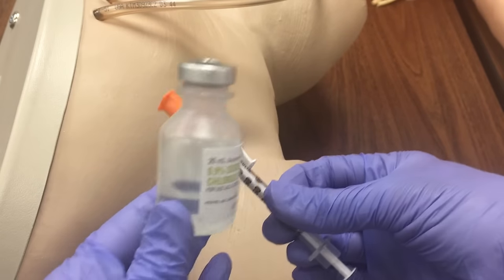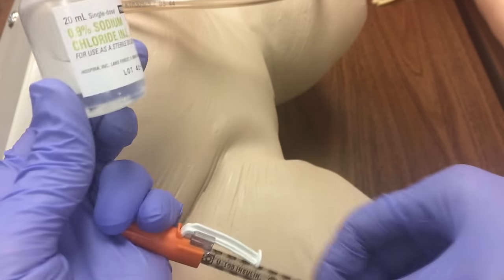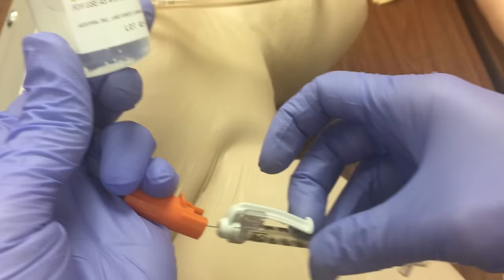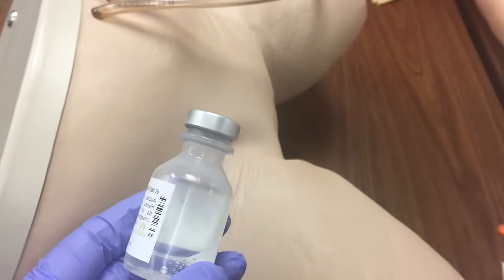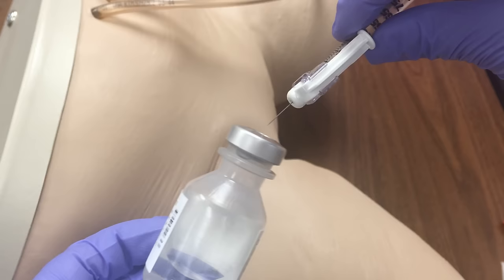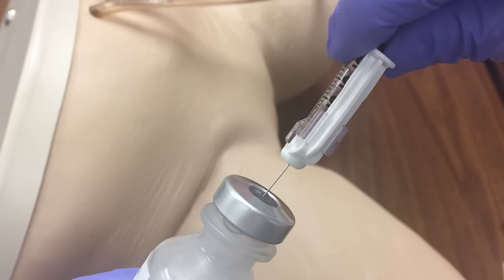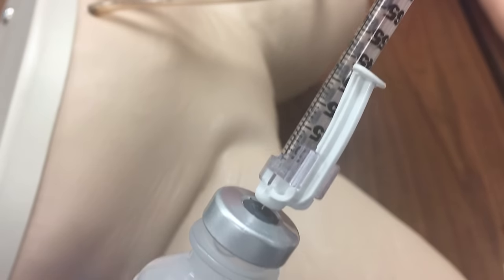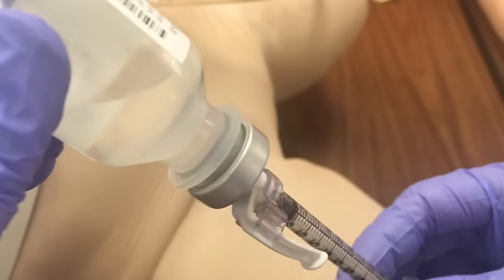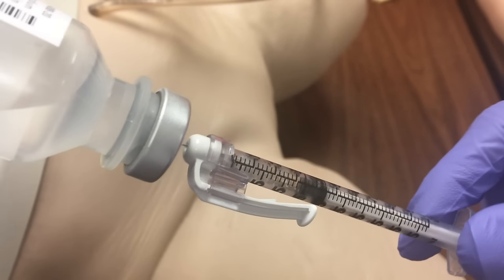The first thing you want to do is pull back to draw up the appropriate amount of air that you need, and then inject that air into the vial. Because these are vacuum packed, it will help the medication come out much easier.